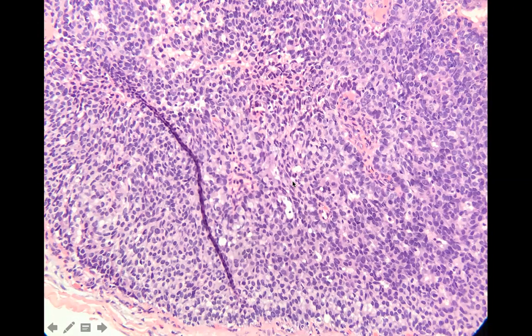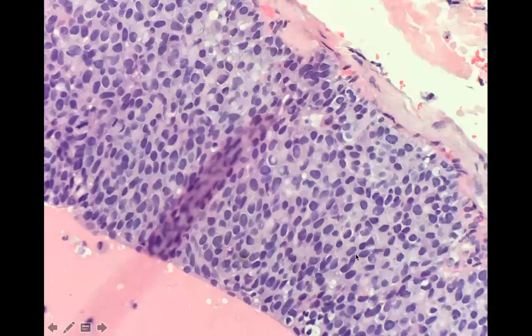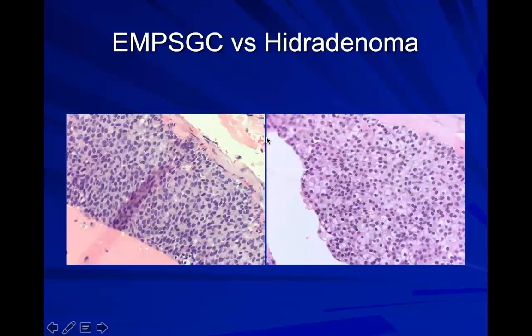You can see it's ductal, it's pretty well circumscribed, so these are low grade, and you can see it's making fluid, but when you go in close, you can see that these cells are atypical. Sorry, when I said endocrine, I meant neuroendocrine. So chromogranin and synaptophysin are neuroendocrine stains that we see in a Merkel cell carcinoma, for example.